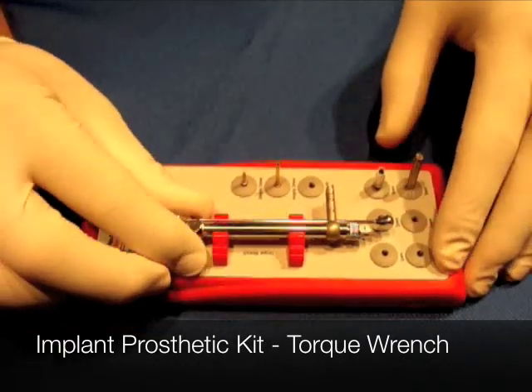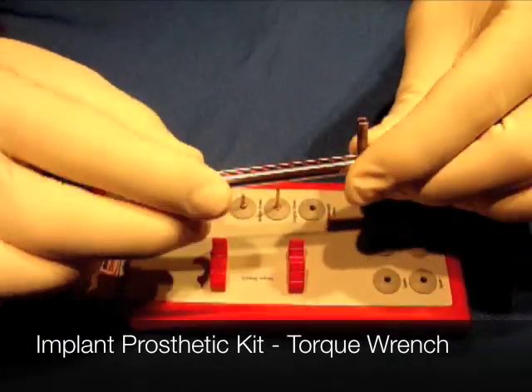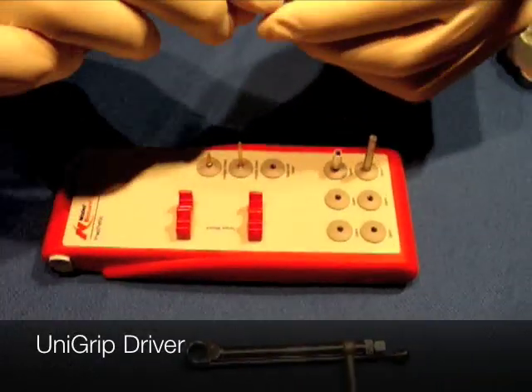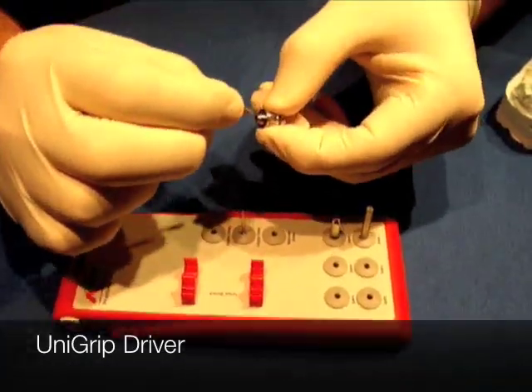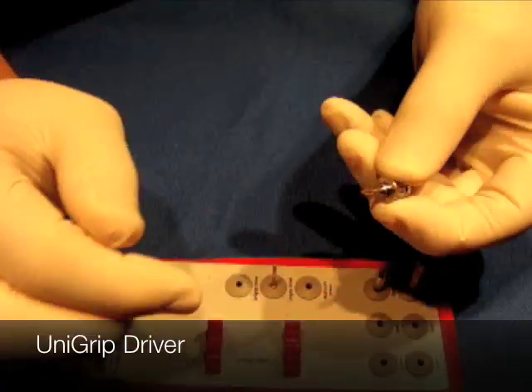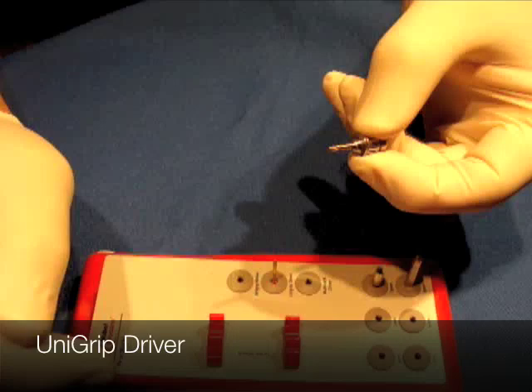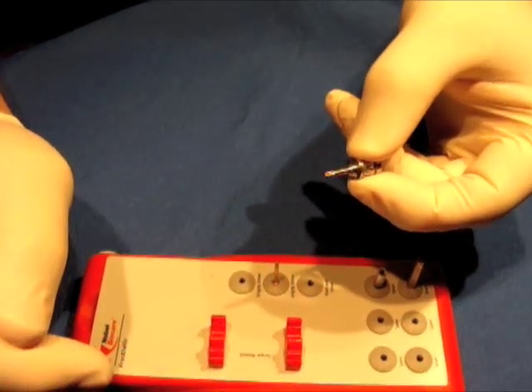When you remove the cover, you'll see inside is the torque wrench itself, and it comes apart. There's a UniGrip driver part that you can take and actually insert the UniGrip drivers into. This is what you're going to use to tighten down crowns and also transfer copings and such.